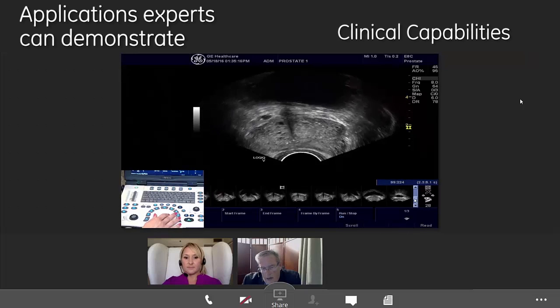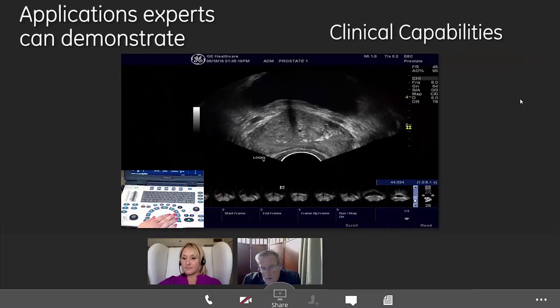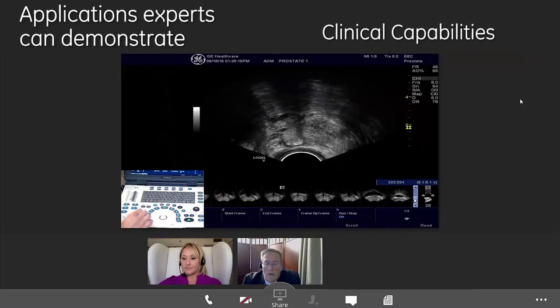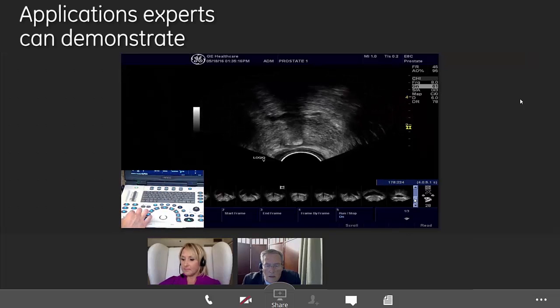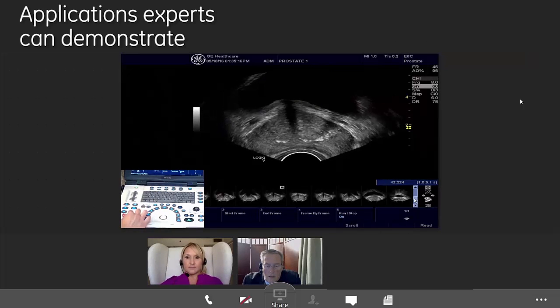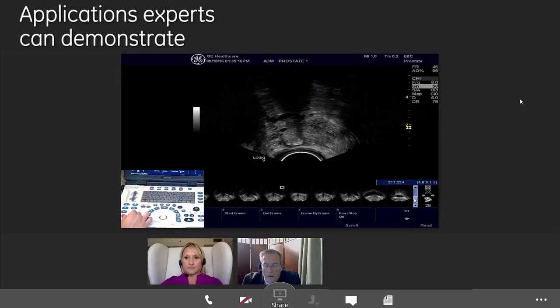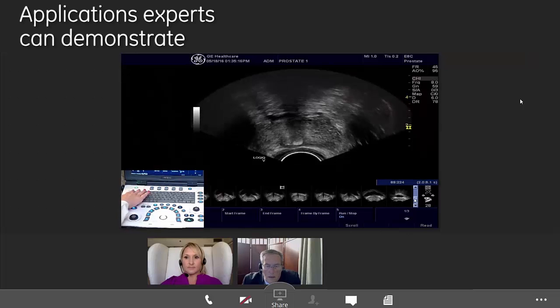To me it seems a little bright. Is there a way to darken that image? Yes, actually. We have what's called raw data on this system. What that gives us is the ability to change some of the key scanning features after the fact. So here you can see I'm adjusting the gain down. We are able to do that, and then we can even change the TGCs in a cine loop afterwards as well.